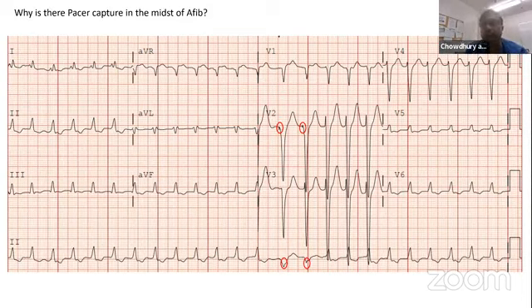Is it regular or irregular? Looks like there is a little irregularity. So it looks like there is a bundle pattern, most likely left bundle pattern, AFib. But then this is for the fellows: why, in the middle of left bundle AFib with fast ventricular rate, is there a pacer spike? I actually added this one because I thought Rafiq Bhai would not be here. But since Rafiq Bhai is here, I added this one quickly.